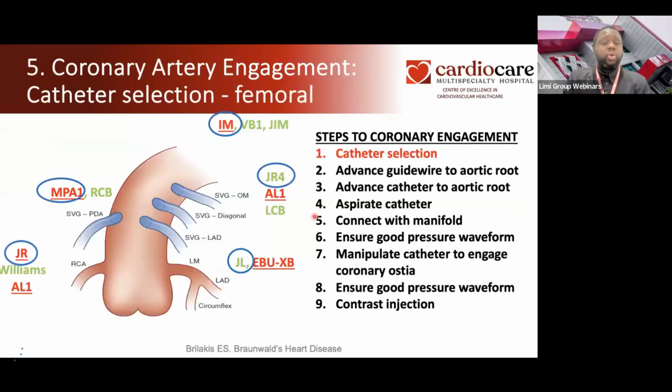But it's very important. So we choose different vessels depending. So for the right, we typically use a JR standard more often than not. For the left, we use a JL standard for diagnostics.